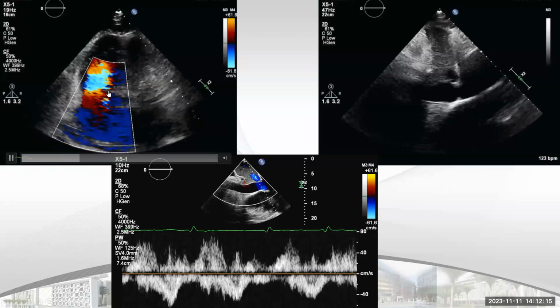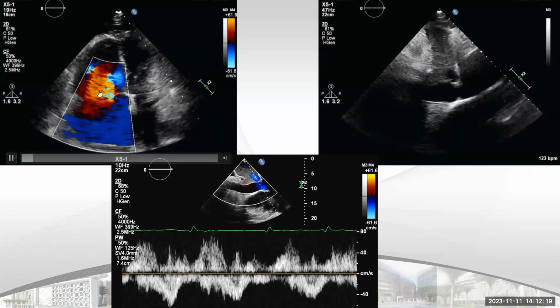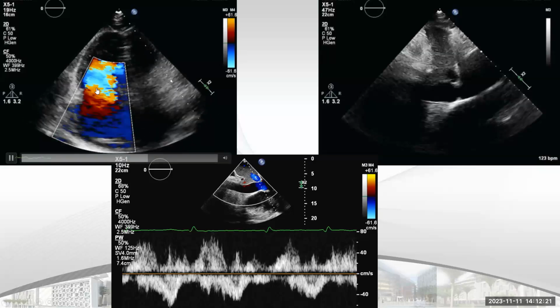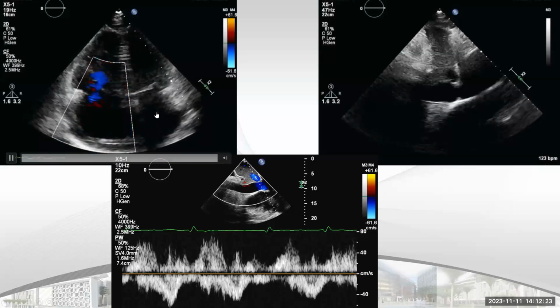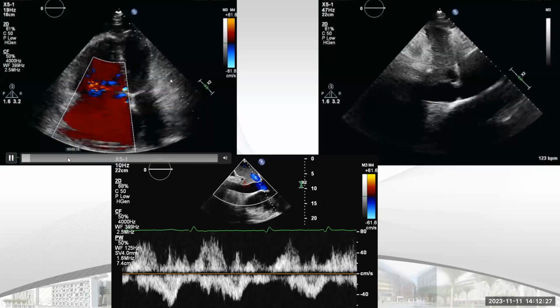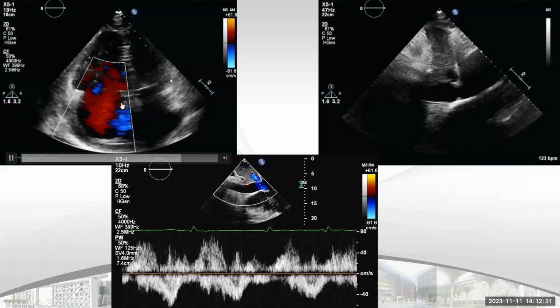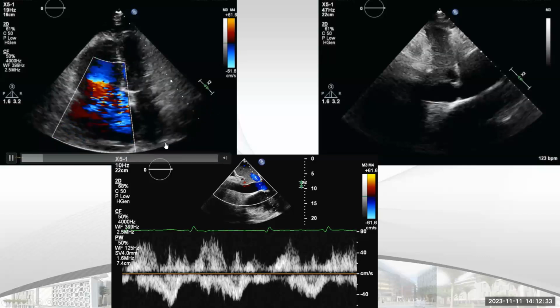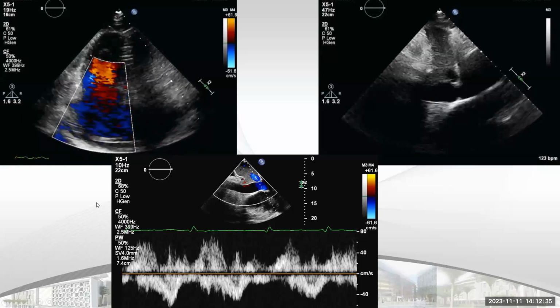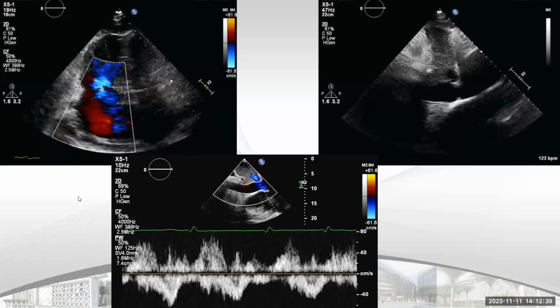On the other hand, what indicates that it is severe is that you have a very wide vena contracta. So remember, the size of any regurgitant jet inside the chamber is not that important. We have many other, more important features. One of them is the vena contracta. The other is whether you have any flow reversal. I'm talking generally about regurgitation, and this applies to all valves.